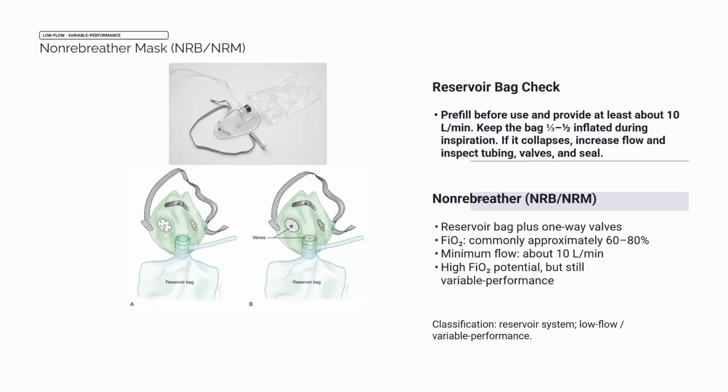That means you can often maintain the same SpO2 using less flow, which extends how long a portable oxygen supply will last. Then pulse demand systems take this even further. Instead of a continuous flow, the device senses the very start of the patient's inspiration and delivers a pulse of oxygen timed to it. Performance varies on this one. Both of these exist for the same reason: portability and conservation, especially for patients on long term oxygen therapy who are up and moving around.